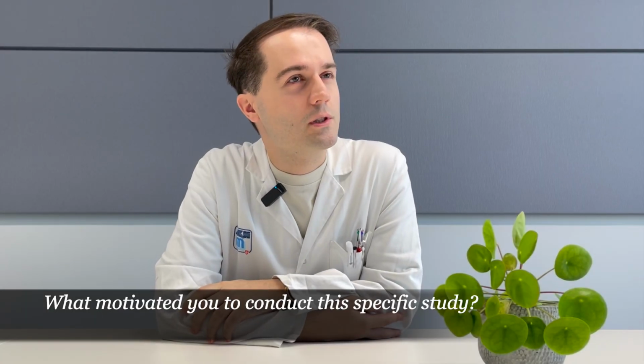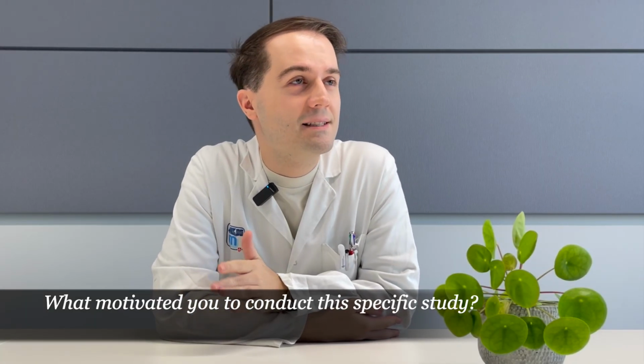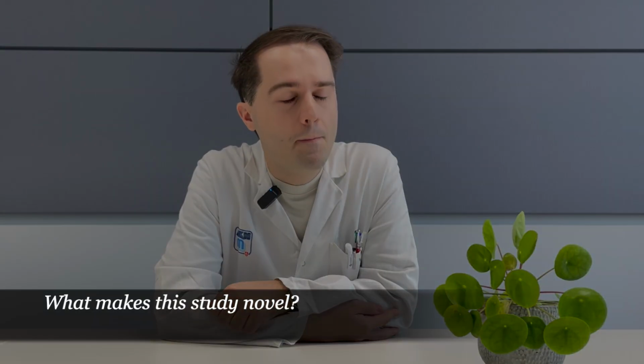Our motivation was clear. Patients with myositis-related interstitial lung disease face unpredictable disease trajectories. Standard tests like pulmonary function tests or CT scanning often fail to tell us who is at high risk of progression. We wanted to see if FAPI PET-CT, this kind of molecular imaging technique, could provide earlier and more reliable prediction.